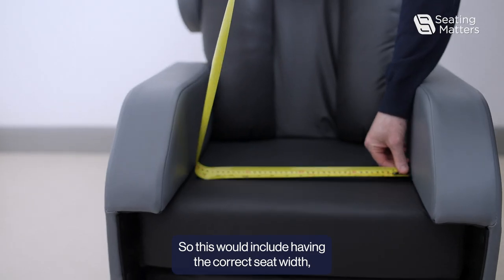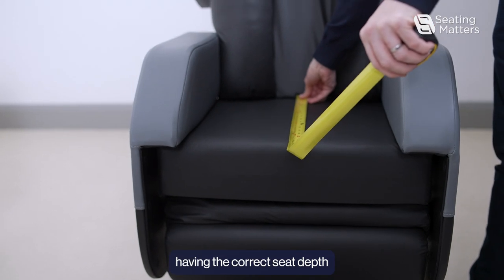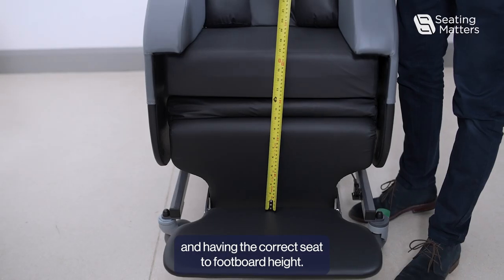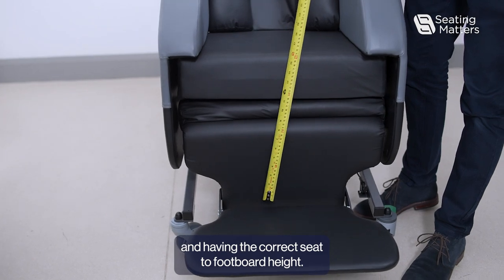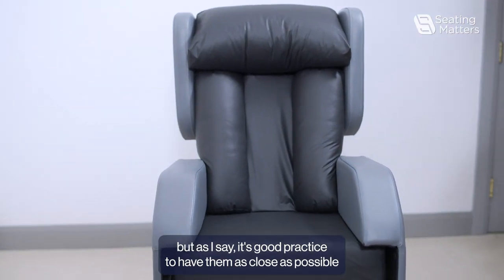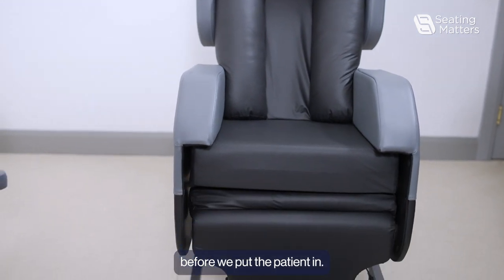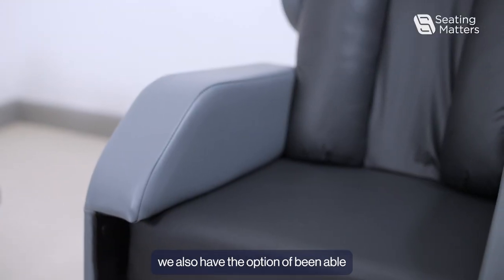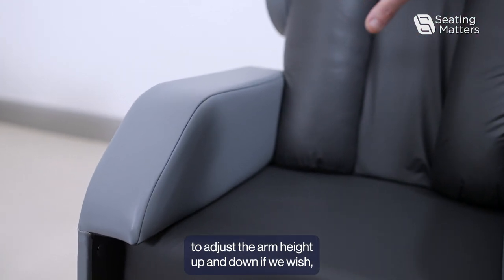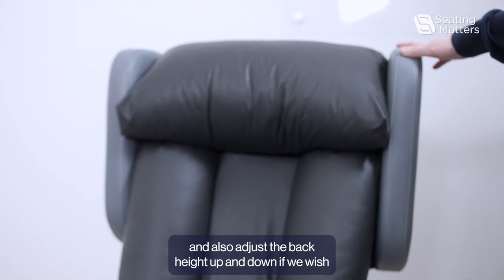So this would include having the correct seat width, having the correct seat depth, and having the correct seat to footboard height. We can tweak these adjustments when the patient is in the chair, but as I say, it's good practice to have them as close as possible before we put the patient in. Because this is a Sorrento 2, we also have the option of being able to adjust the arm height up and down if we wish, and also adjust the back height up and down if we wish.